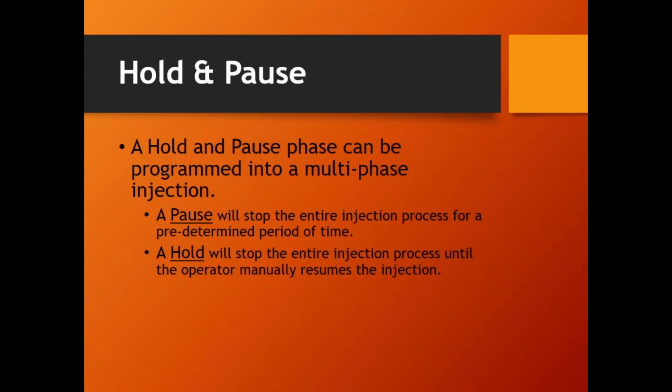Holding a pause, let's go back here, let's do another flush, 5, 20, enter, there we go. Wow, I can't believe let me do that.